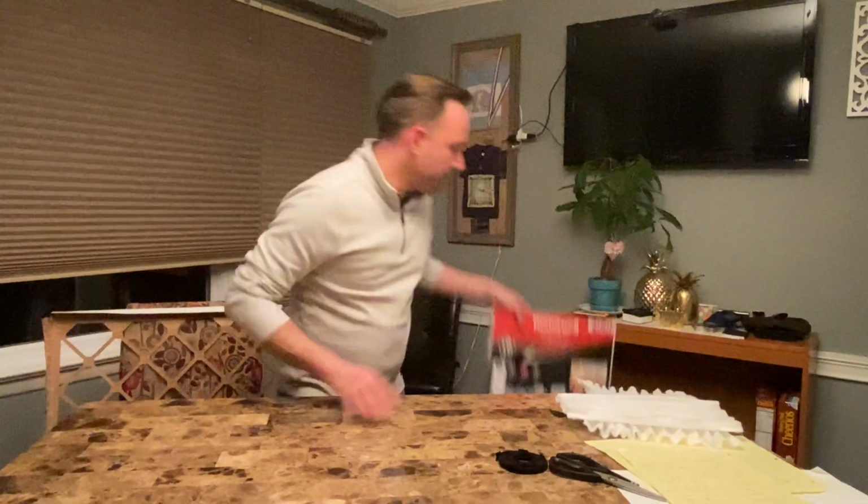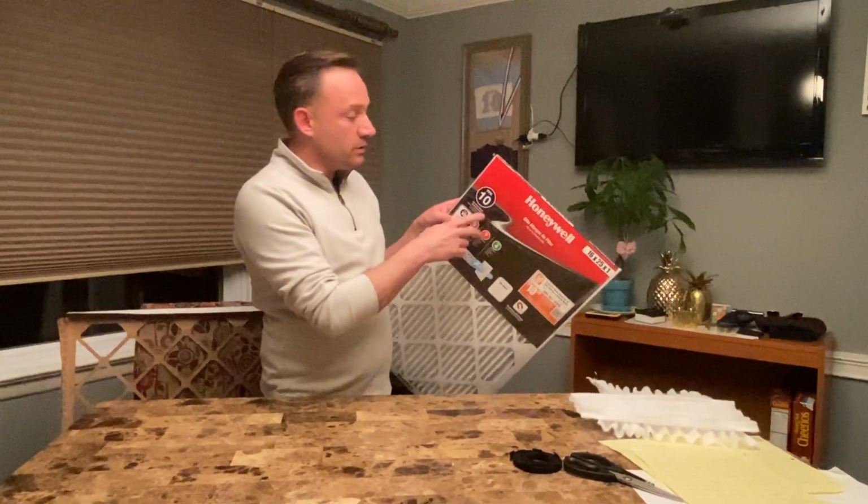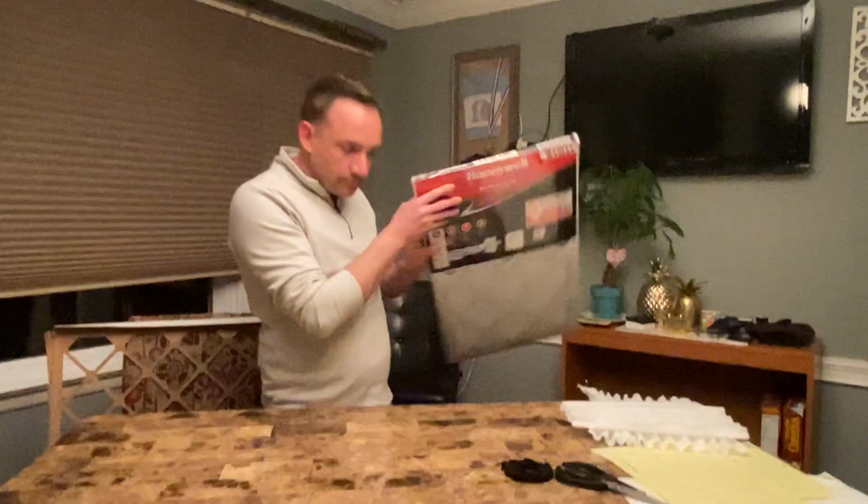Hi guys! I was thinking of some ideas to make your own face mask at home. You can go to your local hardware store, and this is what I found online. So I got an air filter, which is a 10 FPR.